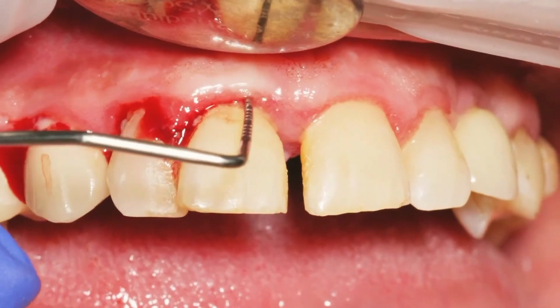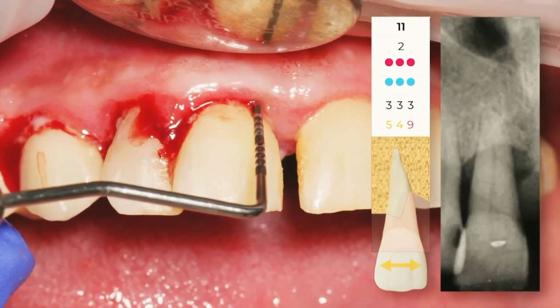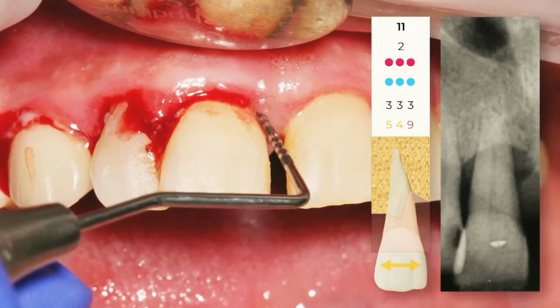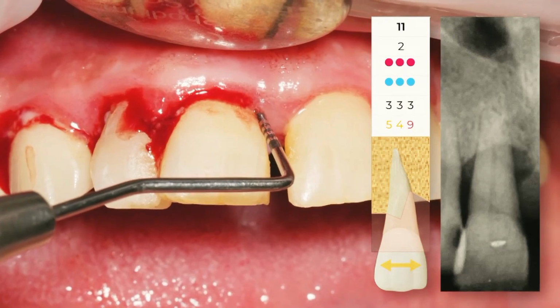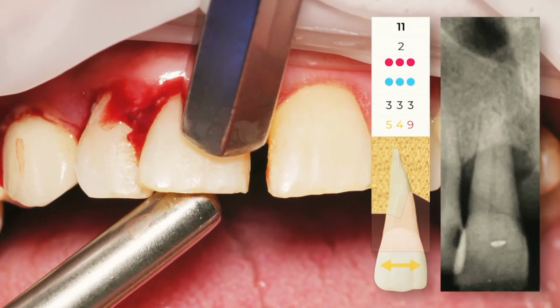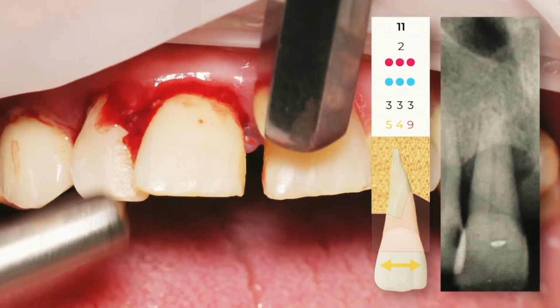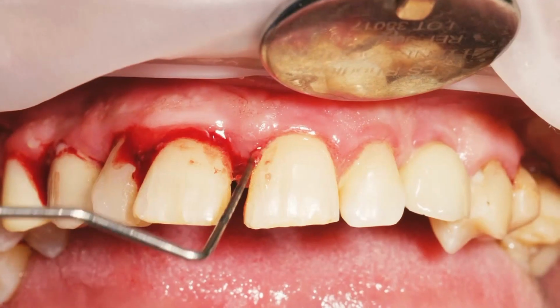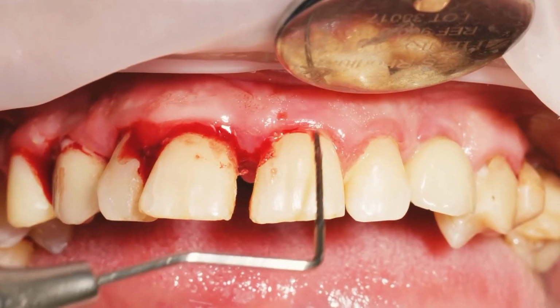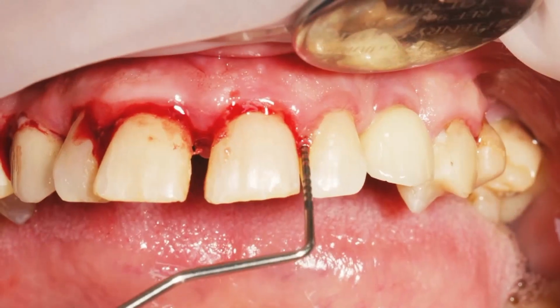We have mobility, for example, in this tooth, 1.2. We have a very severe pocket defect here in the mesial buccal side of 1.1, with bone loss, as you saw in the X-ray.